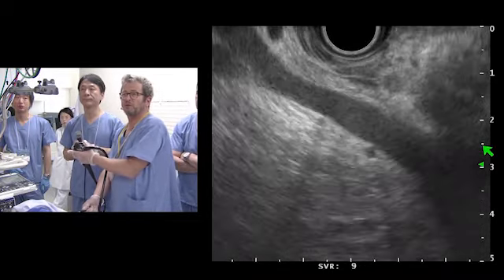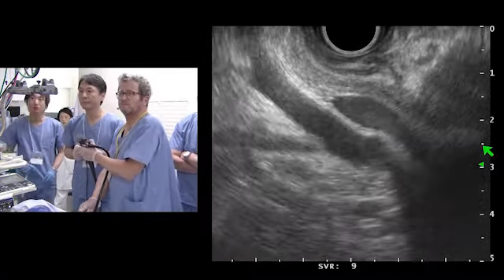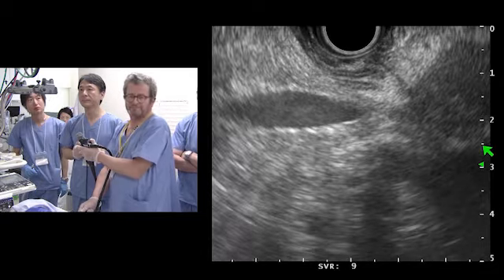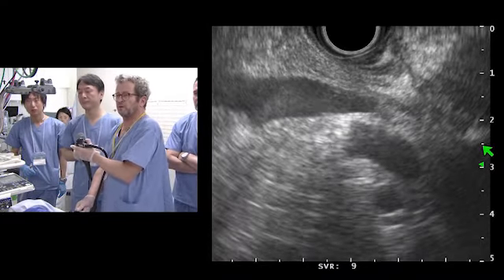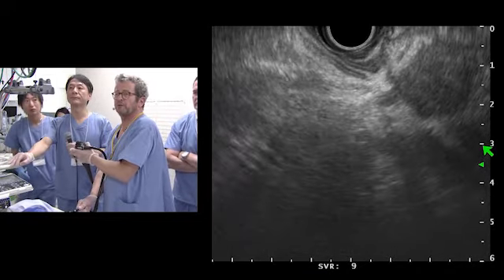Okay? Thierry, can you hear us? Yes? Okay, so this is a nice lesion, operable, the patient is fit for surgery. Is there a need for FNA or FNB? Why not go directly to surgery? Why should we do an FNA? Maybe not. You're right. But this was also something we could discuss, because the lesion is so obvious. Maybe we don't need to perform FNB or FNA.